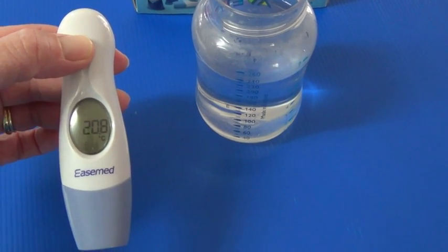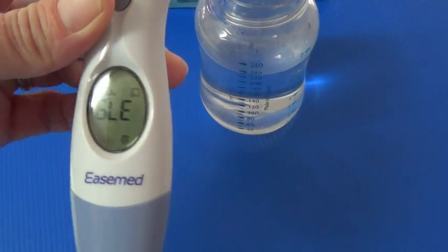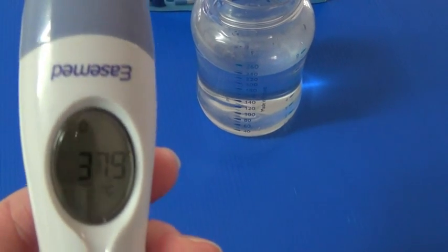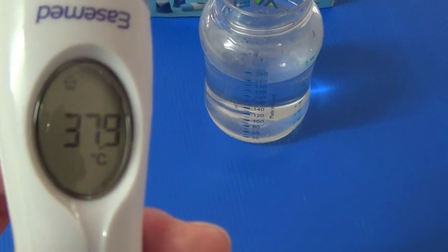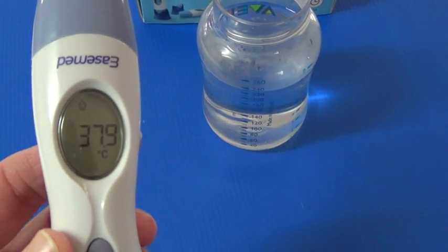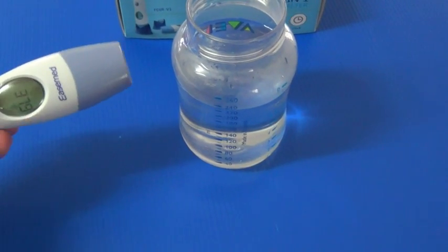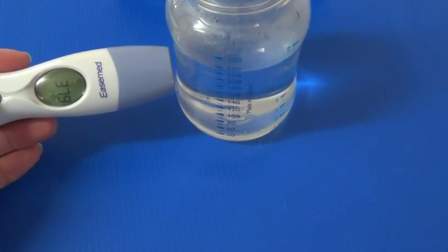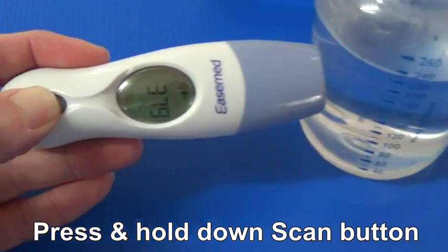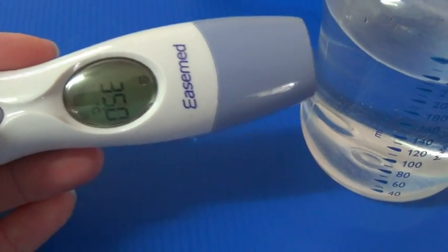Press and hold it down, then release. There is the picture of the house at the top, and it also shows the last measurement that you took in object mode. All we do is simply hold it up near the object like we do with the forehead, press the scan button and keep it held down, then release. Here it will show your object temperature.